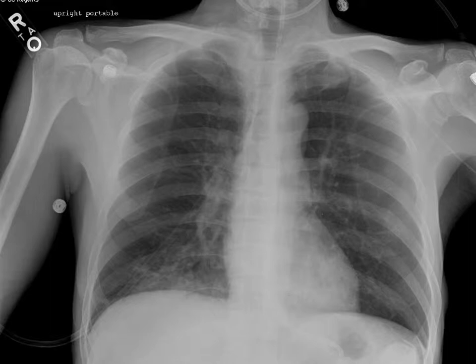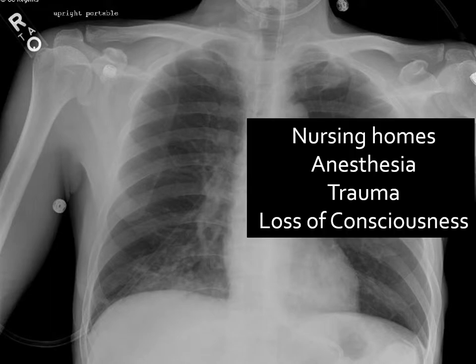Aspiration is where contents from the stomach or swallowed material ends up in the lung where it doesn't belong. It happens for patients in nursing homes, patients sedated with anesthesia, those in a traumatic accident, or who pass out. In this case, it goes with gravity — so it's in the lowest part of the right lung, showing that increased opacity.